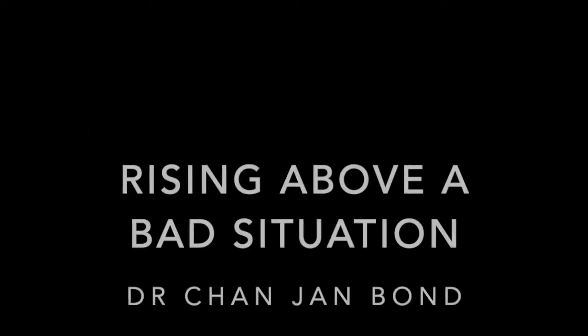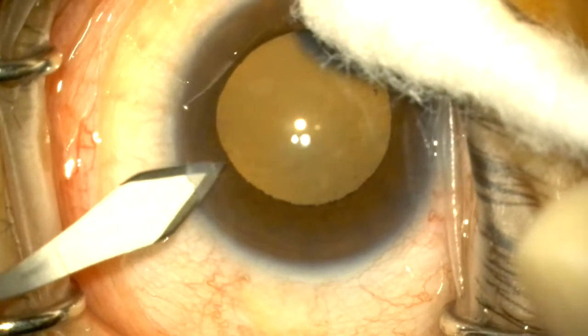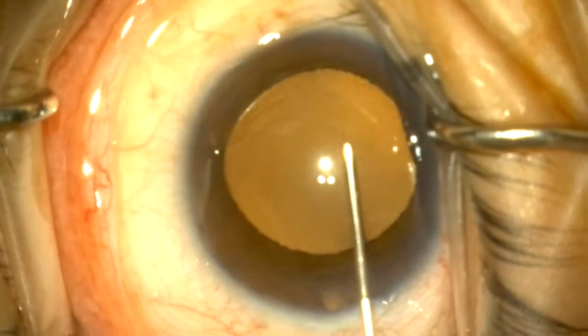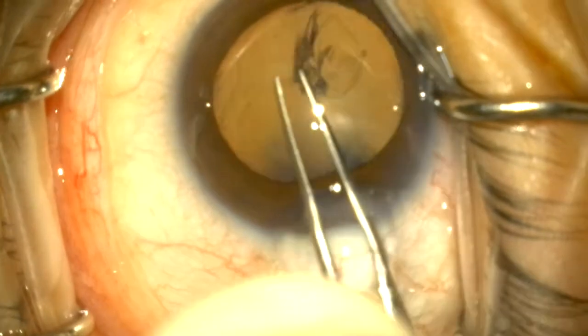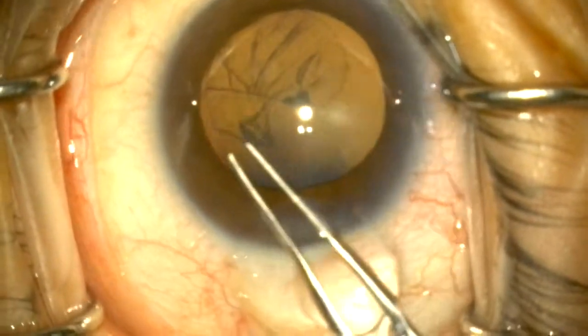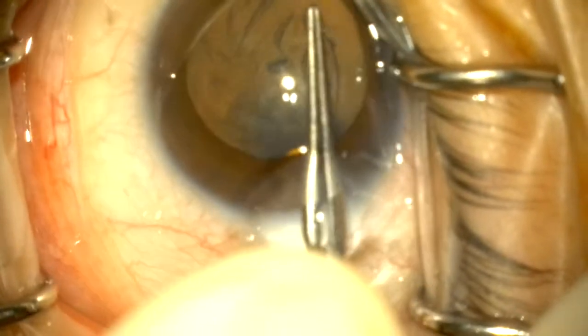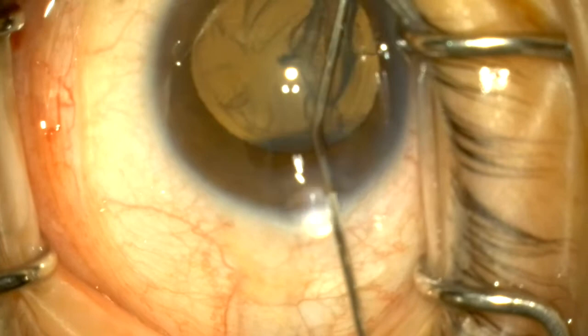Today we'll be talking about rising above a bad situation. This is an interesting case of a 50-year-old Chinese businessman who has mild cataract on both eyes. His vision was 6/9 on both eyes. He wishes to be spectacle-free and hence opted for a trifocal lens implant. It was planned for a trifocal toric lens.